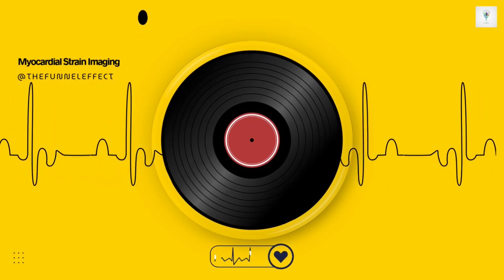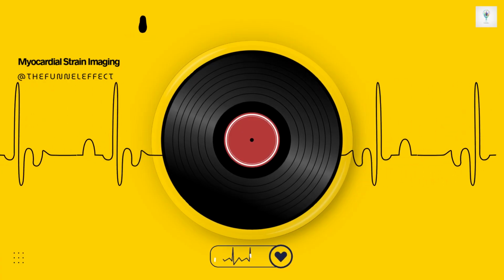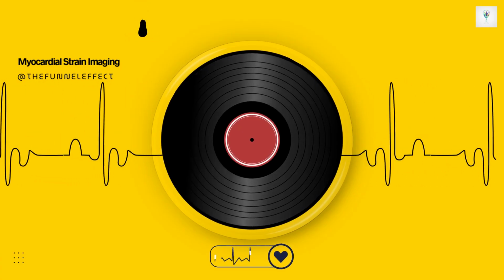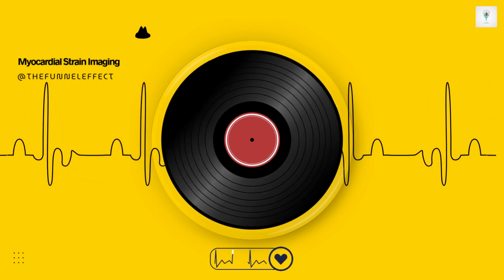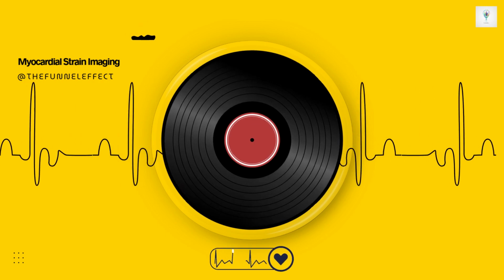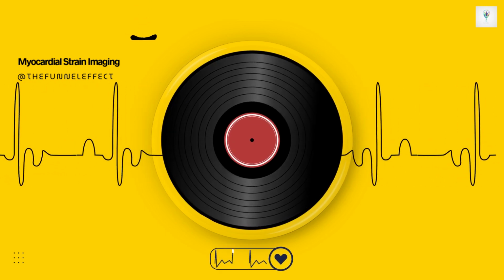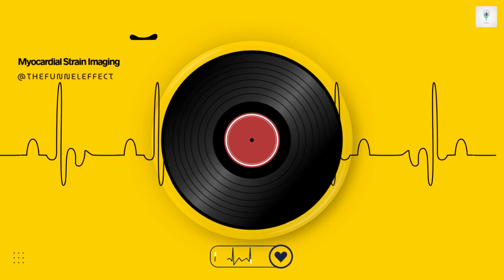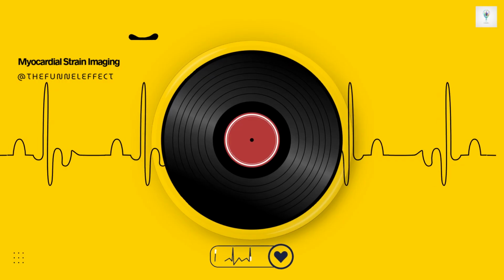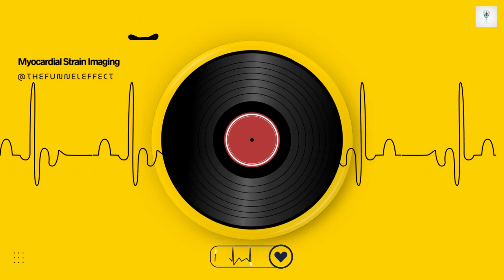Okay. Let's move beyond the LV now to the left atrium, or LA. Measuring strain here seems crucial for understanding diastolic function and filling pressures. Absolutely. The LA isn't just a passive chamber, it plays three active roles during the cardiac cycle. It acts as a reservoir, collecting blood from the lungs while the LV contracts. It acts as a conduit, allowing passive blood flow into the LV when the mitral valve opens. And it acts as a pump, actively contracting in late diastole to top off the LV filling.